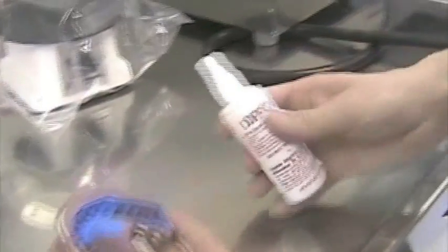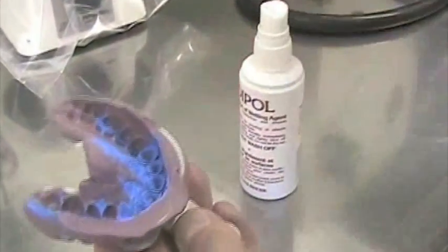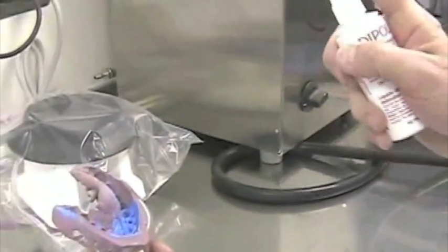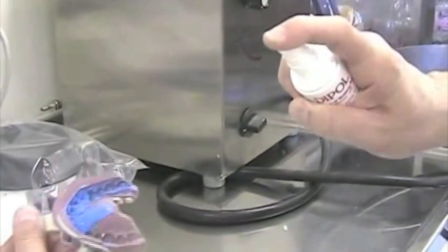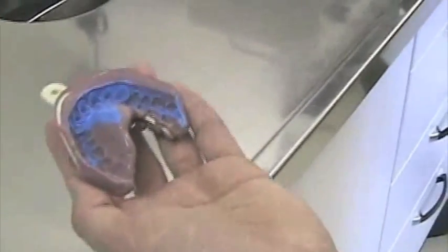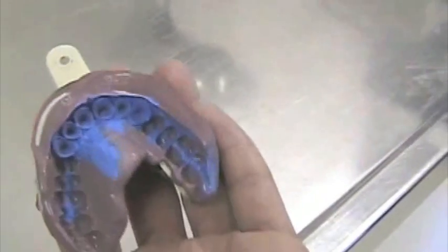So let's pour the impression. We are going to spray some wetting agent, some debubblizer, in order for the stone to really capture every detail inside the impression. We need to reduce the surface tension. So we spray the impression with the little bottle, keeping it at a distance, just a few times like this. And we can use a little bit of air to just remove the excess.